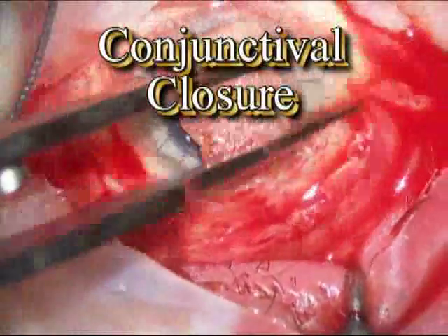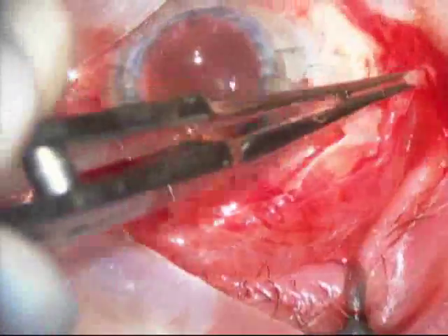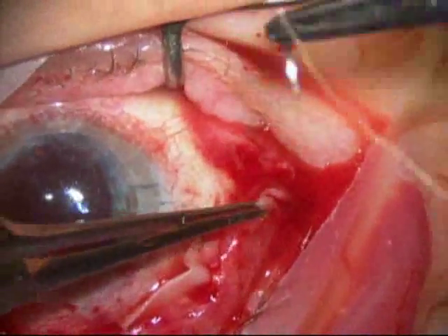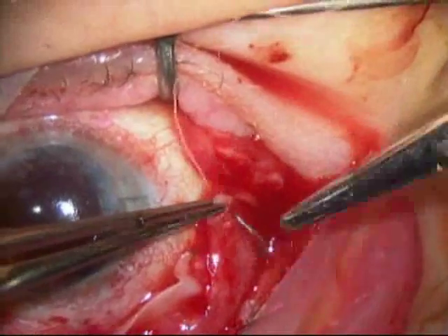This surgery is done with local anesthesia and the patient is sedated for much of the surgery — she had minimal discomfort. You're seeing a little bit of anesthetic being placed around the eye at the conclusion of the surgery, and then the conjunctiva is closed with a suture which will reabsorb within a week or two.